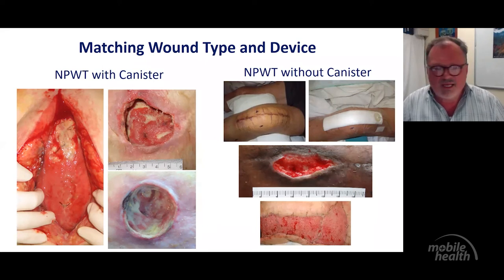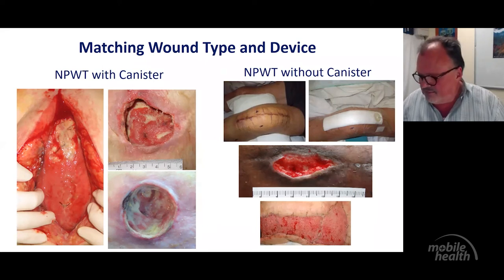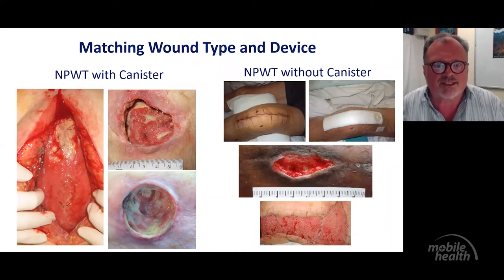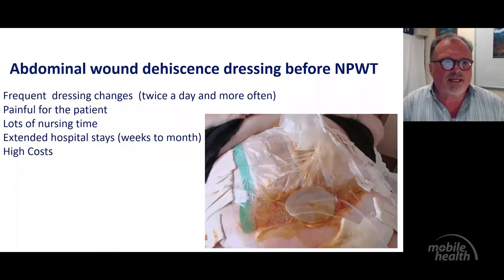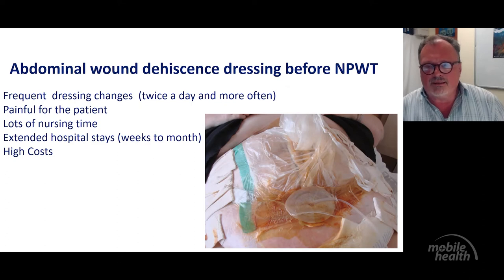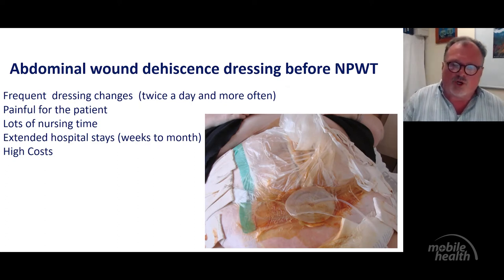Now comes one of my most treasured pictures in my career. So I'm very proud of this, because most of you young practitioners out there will not have seen that. And you can see on my glasses that I'm getting old, but I show you this because that's what happened before we had negative pressure. So before we had negative pressure about 20 years ago plus, we had this type of arrangement, and every arrangement was unique. So we had an open abdomen here after gastric surgery and infection, and the wound was left open in theater and so forth.